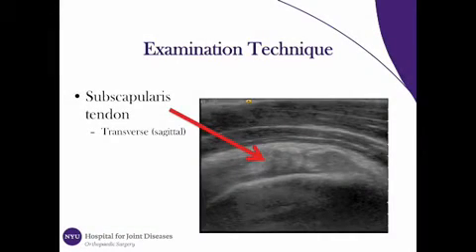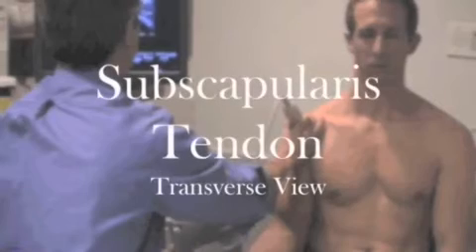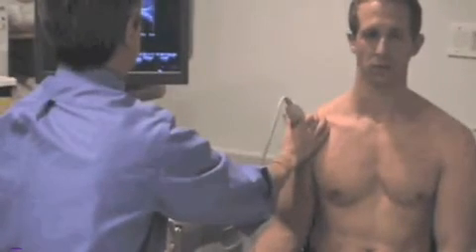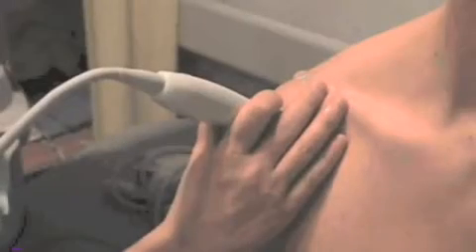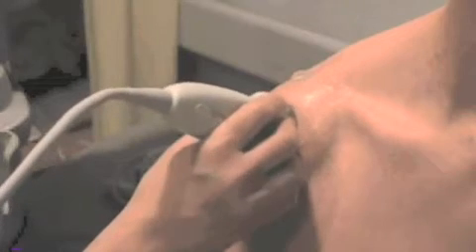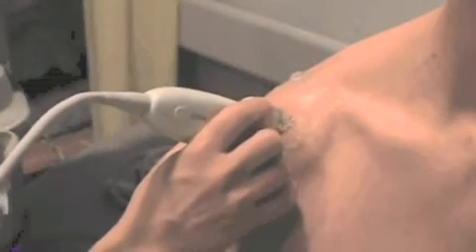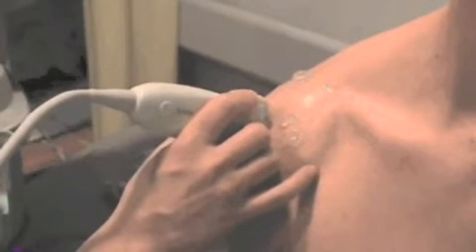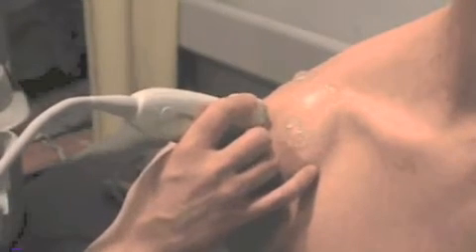The subscapularis tendon is also imaged in the transverse plane as seen in the picture on the right, demarcated by the red arrow. The following video will demonstrate the appropriate technique. In order to image the subscapularis tendon in the transverse plane, the probe is simply rotated 90 degrees. This close-up video shows how the probe can easily be transitioned from one image plane to the other with a simple turn of the wrist. The probe can then be moved laterally and back medially in order to image the entire subscapularis tendon.